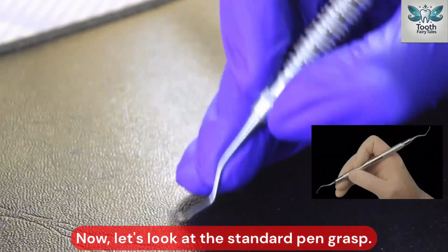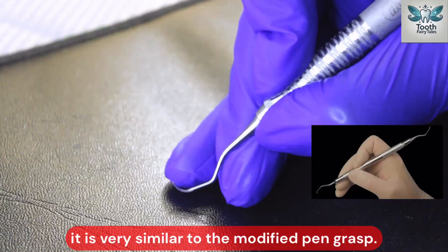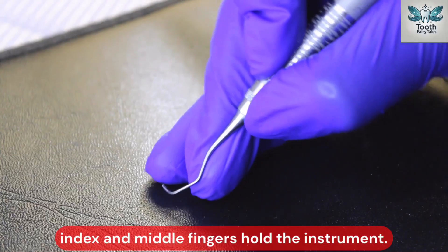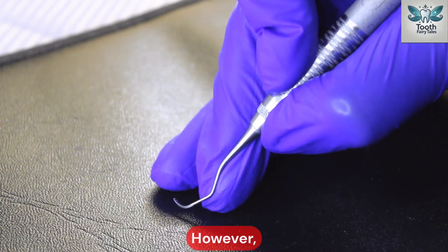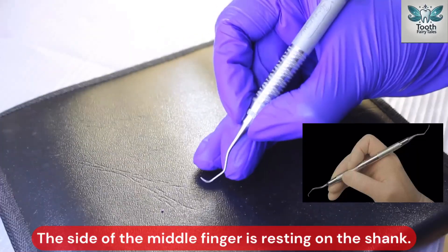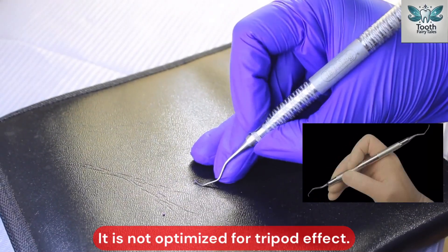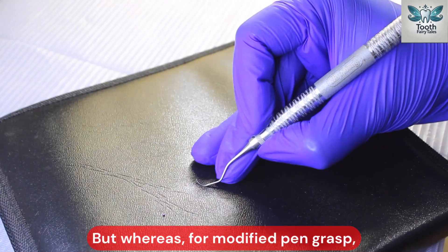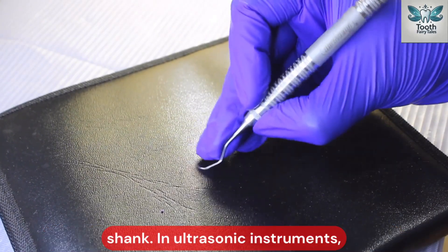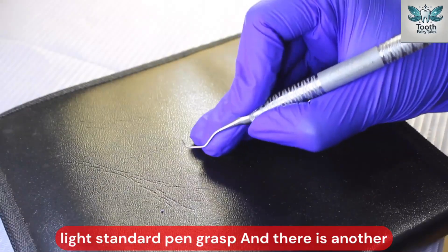Now let us look at the standard pen grasp. It is very similar to the modified pen grasp — the thumb, index, and middle fingers hold the instrument. However, notice the placement of the middle finger: the side of the middle finger is resting on the shank, and it is not optimized for the tripod effect. In the modified pen grasp, the side of the middle finger pad rests on the shank for better control. For ultrasonic instruments, a light standard pen grasp is used.